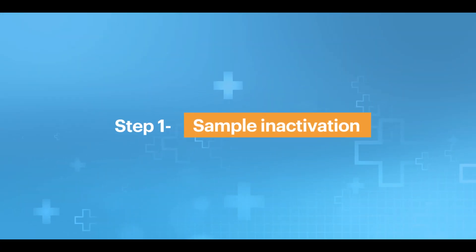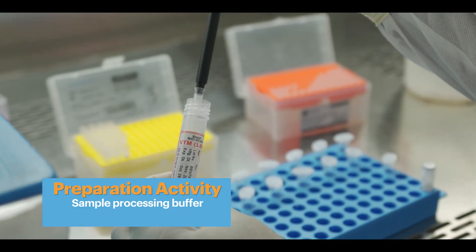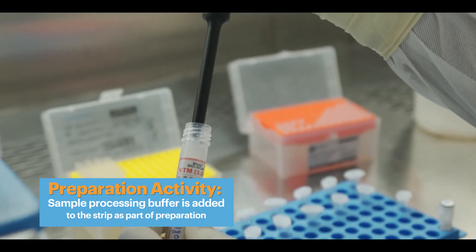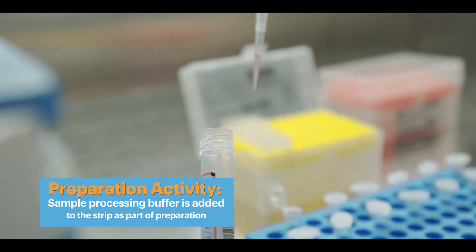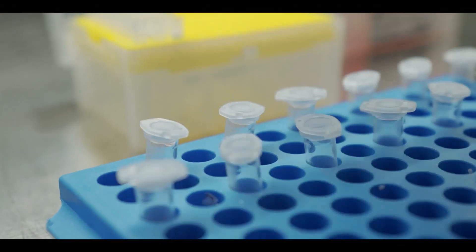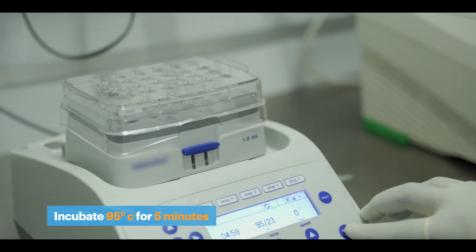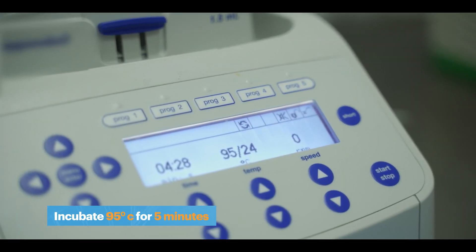Step 1: Sample Inactivation. After registering, the sample is added to the microcentrifuge tube or strip along with sample processing buffer. The tube or strip is incubated at 95 degrees Celsius for 5 minutes in a heat block.